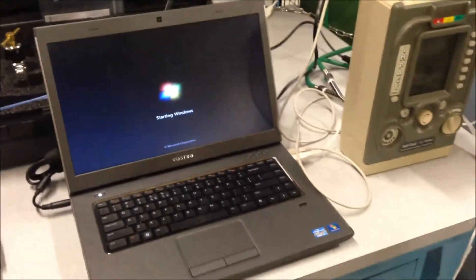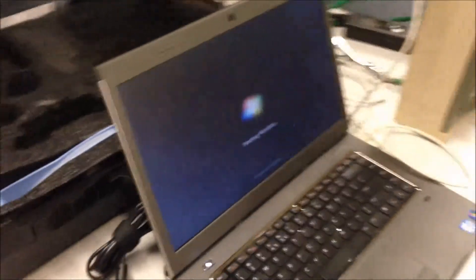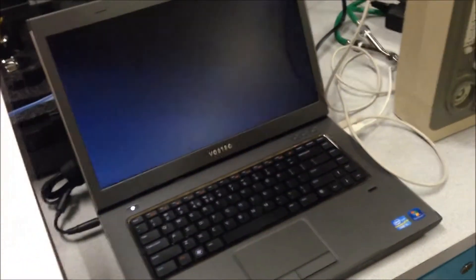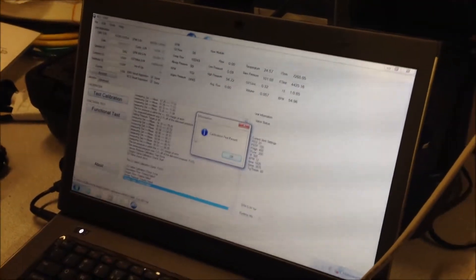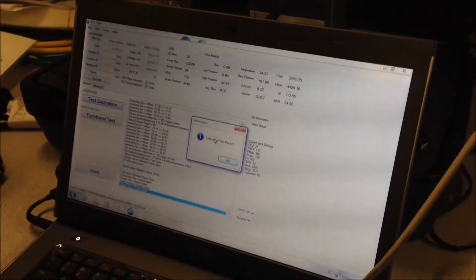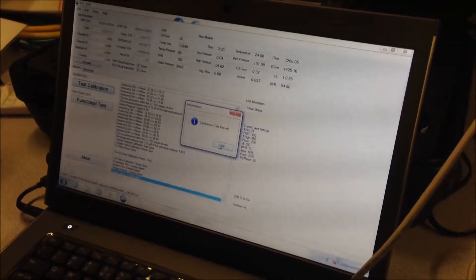Boot up the computer system and begin the calibration procedures that are included with the remote calibration system. Once you correct your issues that are pointed out on the screen and you re-run the calibration test and your system passes, you will have an information box that lets you know that the test passed. Hit OK.